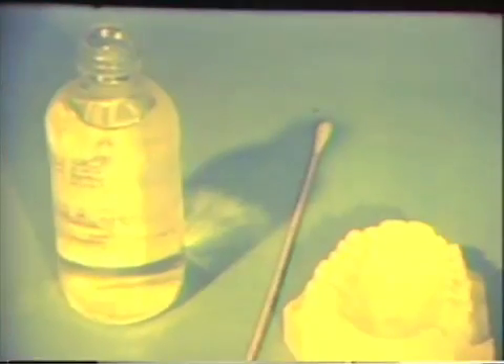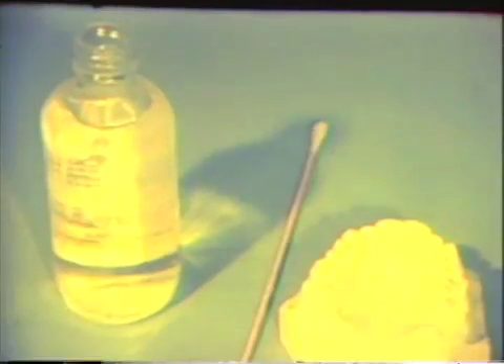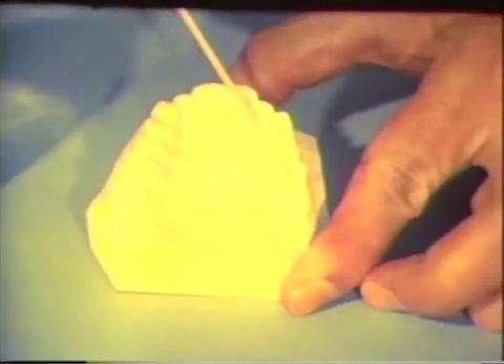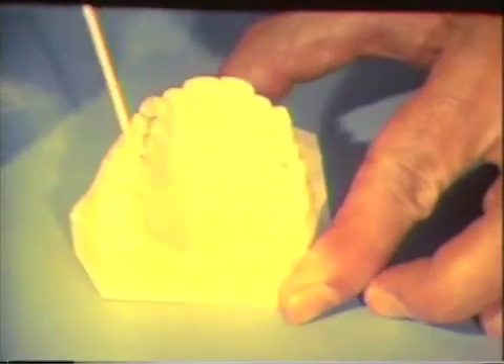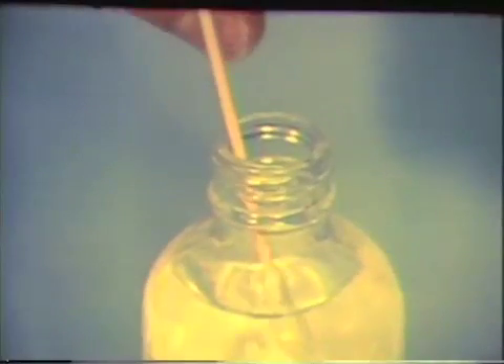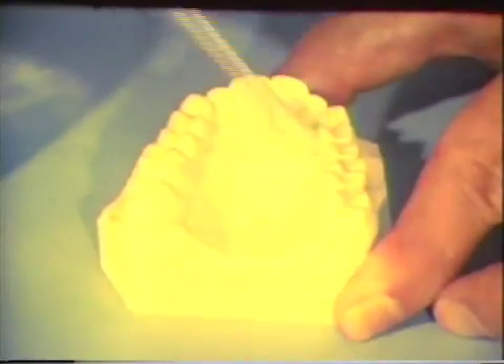An accurate maxillary cast and a separating liquid are needed. Undercuts related to the teeth have been blocked out with plaster. The area where the separating fluid should be applied is outlined. The fluid should coat the entire area that is to be covered with wax. A sheet of hard base plate wax is softened in hot water.